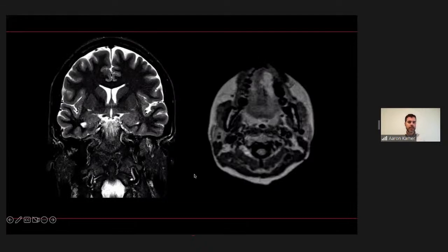Okay, so Jared, tell me what you're seeing on this image. All right.